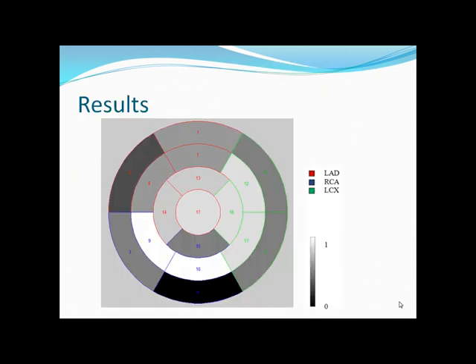And finally, in our results section we have shown that a neural network based approach is considered here for classification purposes, and disease is considered if the percentage of diameter stenosis is more than 70%.